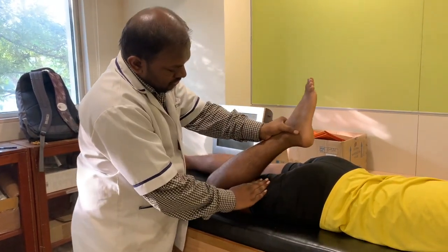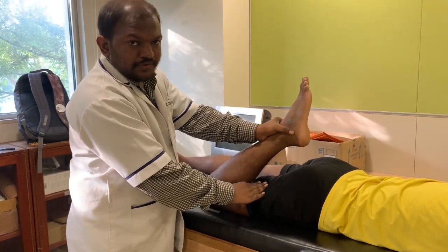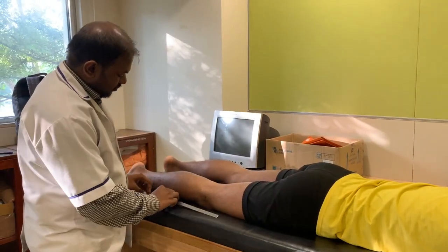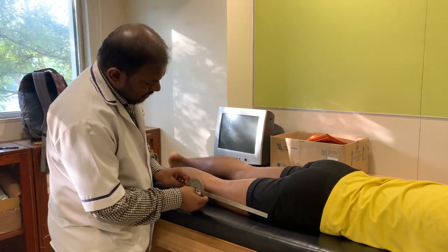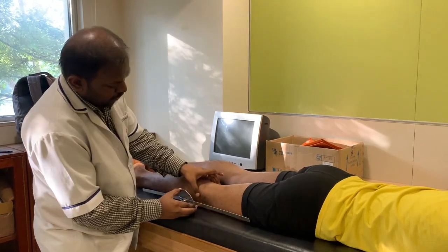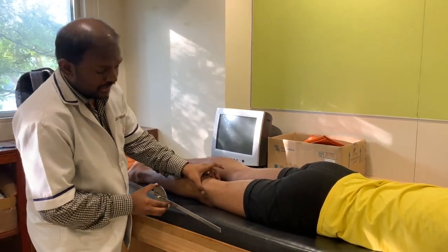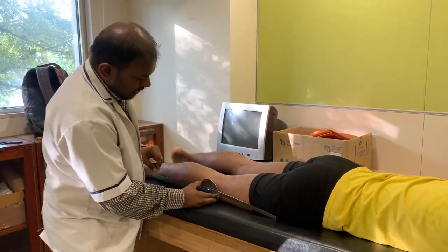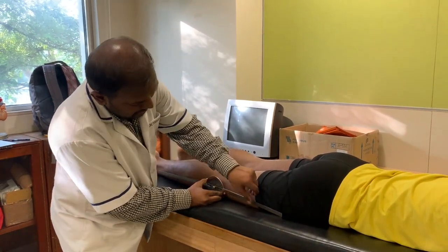So here again you will get a soft end feel at the end of knee flexion range of motion. To check in prone lying, where you have marked the lateral epicondyle, there you keep the fulcrum, which should coincide.